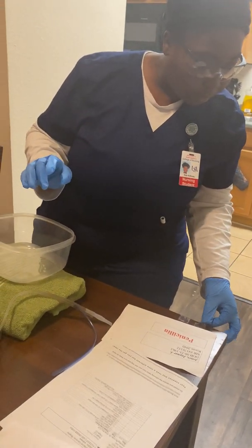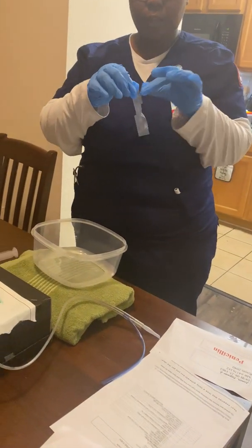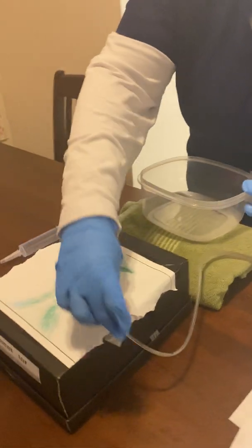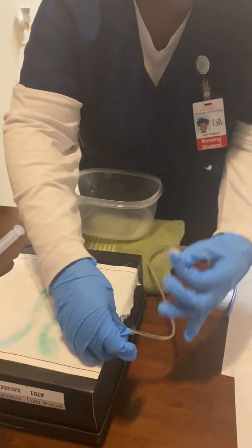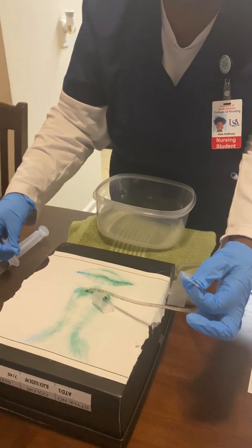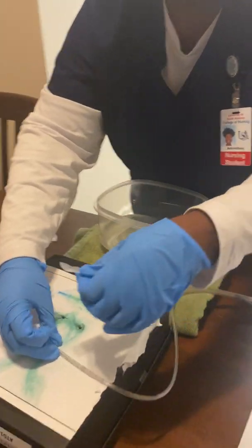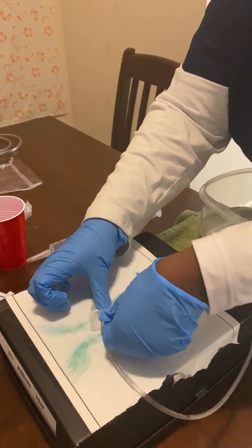If I can get it to stop sticking to my glove. I'll get ready to remove, and then place it across the nose.